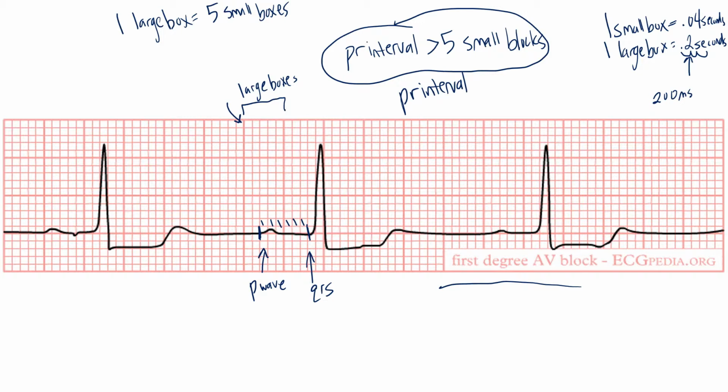But when you look at the graph, here's the P wave, here's the QRS, and then you have the T right here. And then again, here's the P wave, QRS, T right here, P wave, QRS, T right here. So it has a correct pattern other than the PR interval being wrong. The QRS looks normal. There are also other diseases I'll talk about in other videos where the QRS is too long in this section, but just for our sake, this is normal here. And the P wave, as far as how it looks, is normal.